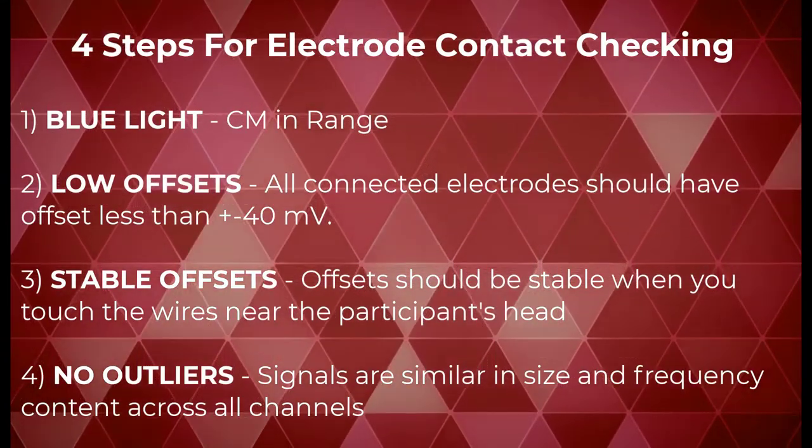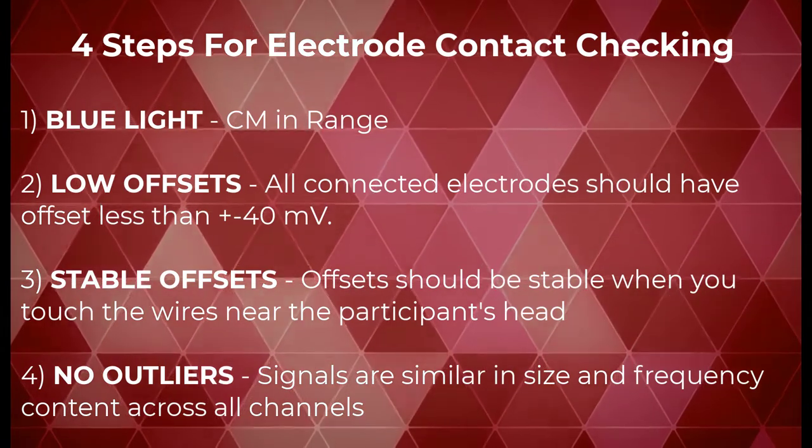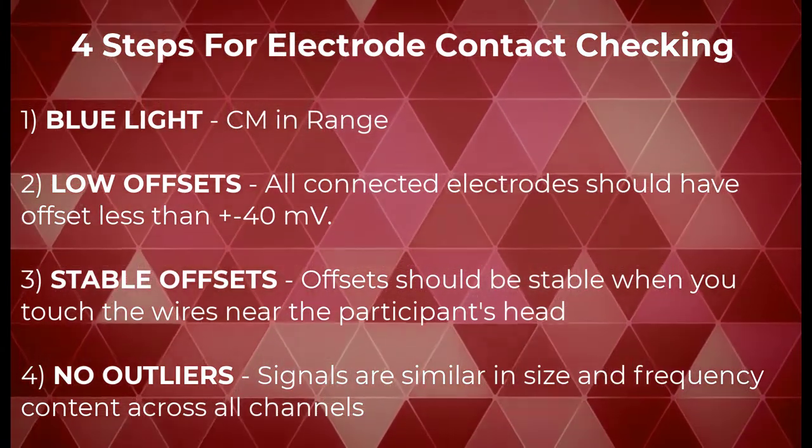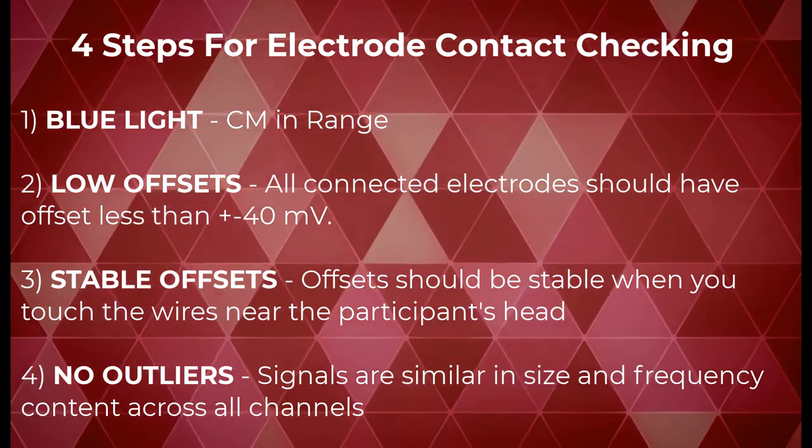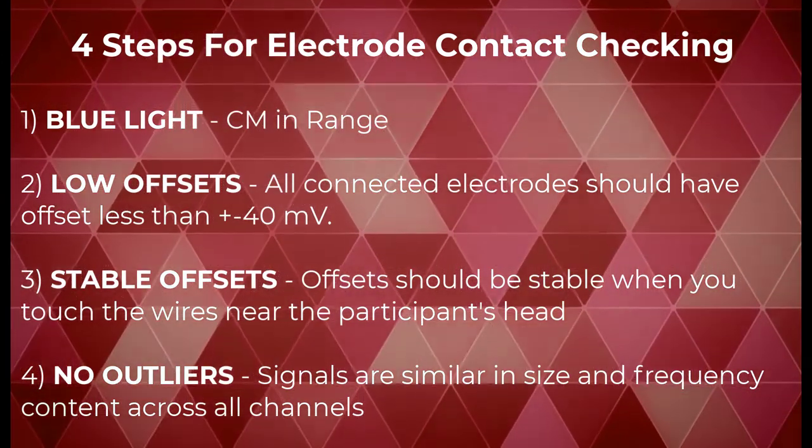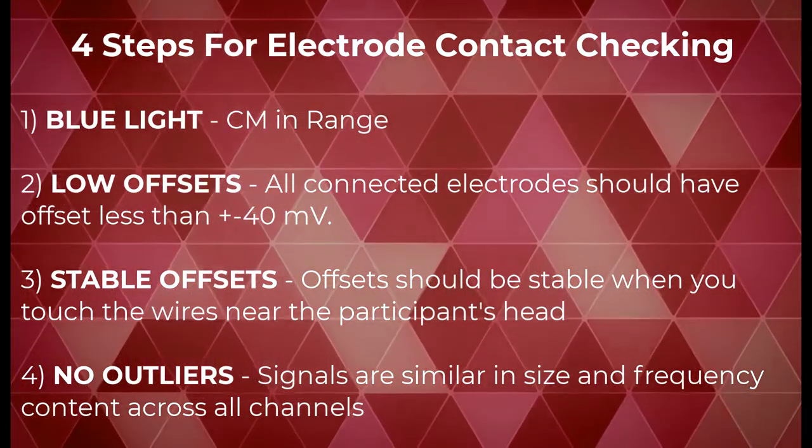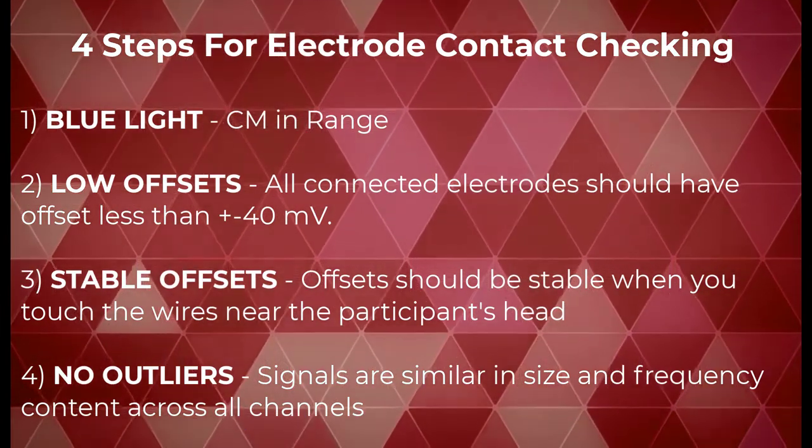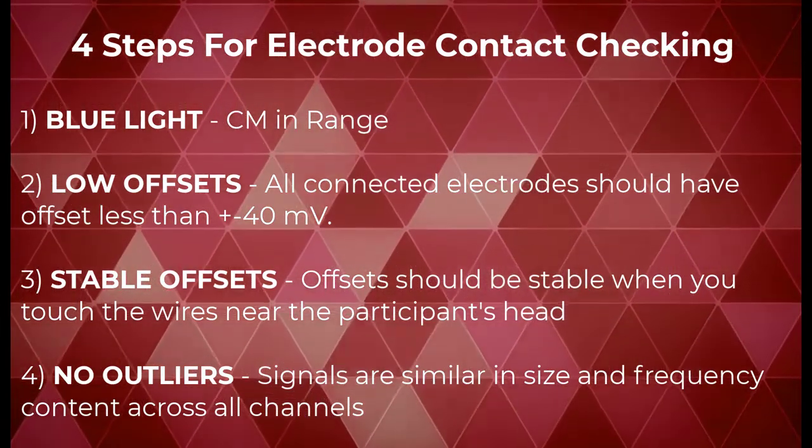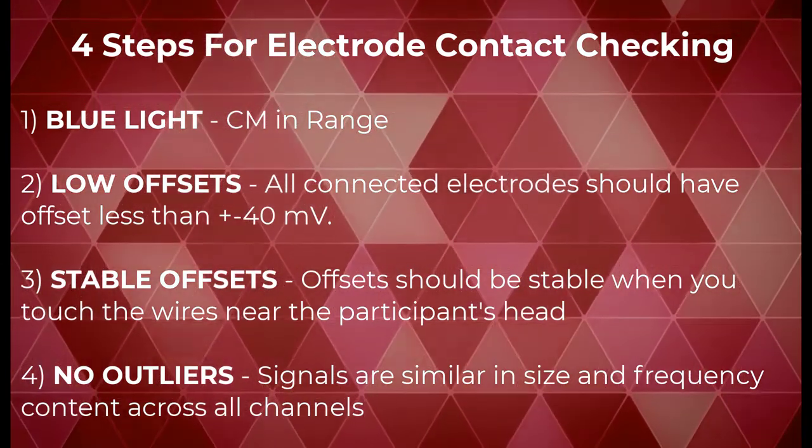Next comes a four-step electrode contact check. One, blue light, meaning CM is in range. Two, low offsets, meaning all connected electrodes should have offset less than plus or minus 40 millivolts. Three, stable offsets. Offsets should be stable when you touch the wires near the participant's head. Four, no outliers. Signals are similar in size and frequency content across all channels.